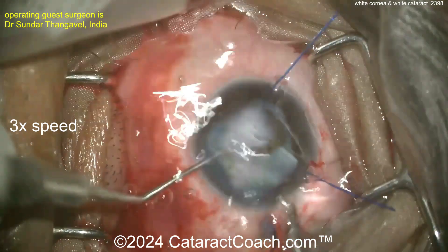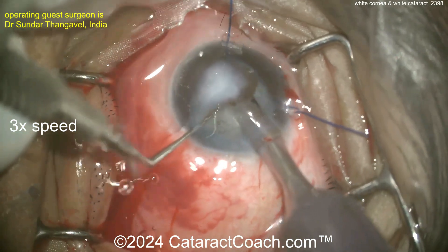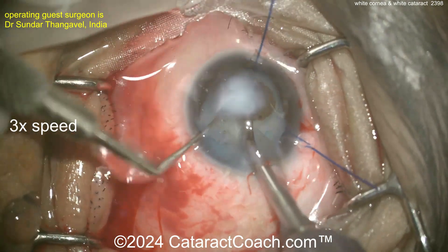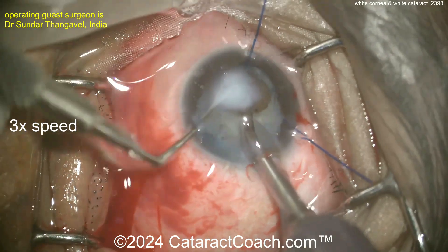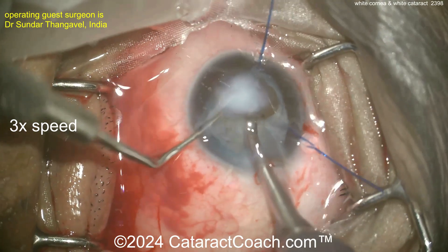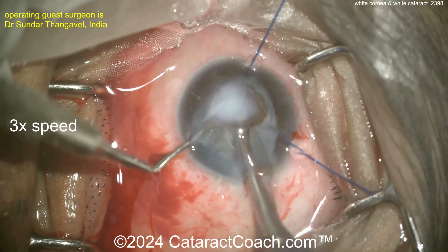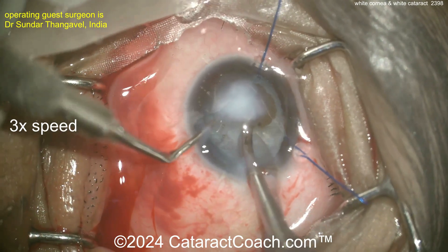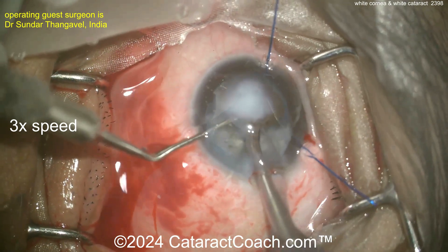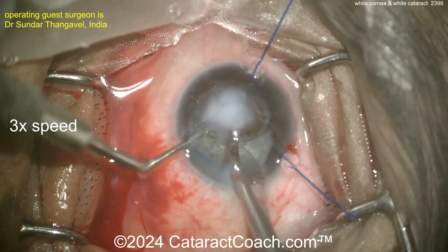Hopefully this is a softer white cataract — let's see as you aspirate this out, does it come up pretty easily? The tough part is the surgeon's vision is very difficult because you're trying to look through or beyond that central opacity. I'd like to get the nucleus chopped up and bring the pieces into an area of clearer cornea so you can see what you're doing. This is a super challenging case — I would not recommend it for a beginning surgeon. It looks like a chop has been accomplished, though it's hard to see on the video.